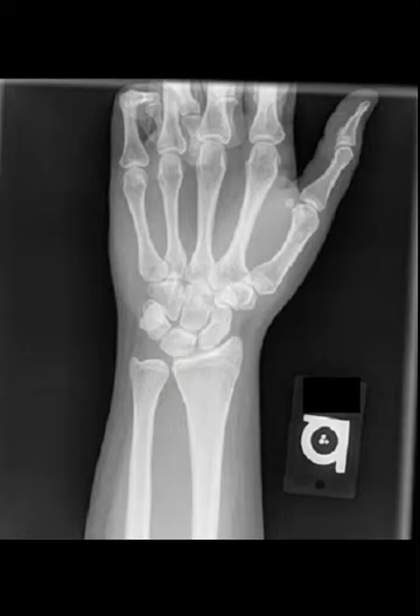Now to move on to our carpal bones. The proximal row has four carpals and the distal row has four carpals. Starting with the proximal row: here is the scaphoid, next is the lunate, followed by the triquetrum and the pisiform. Distal row: trapezium, trapezoid, capitate, hamate. And this is a great example of the hook of the hamate right here.